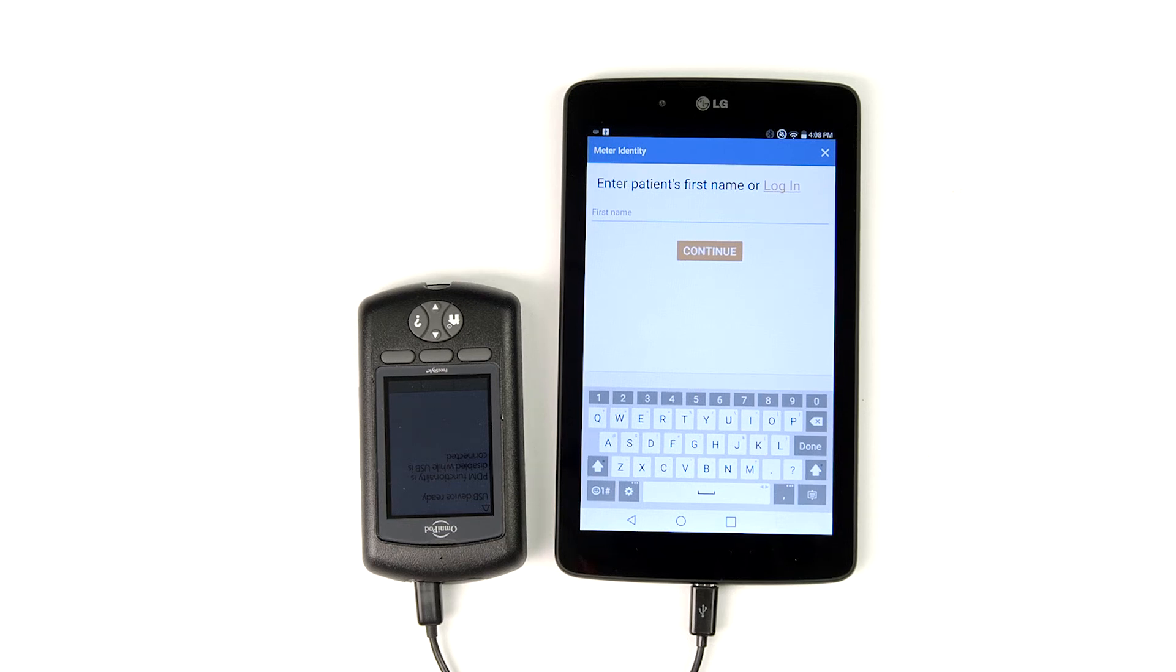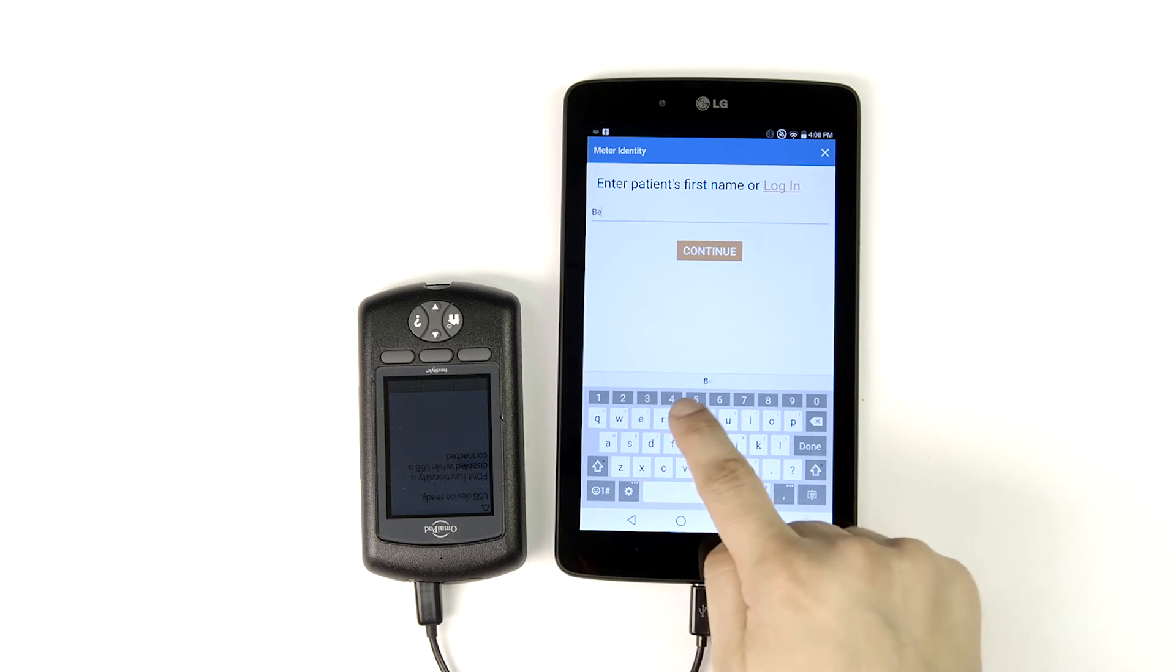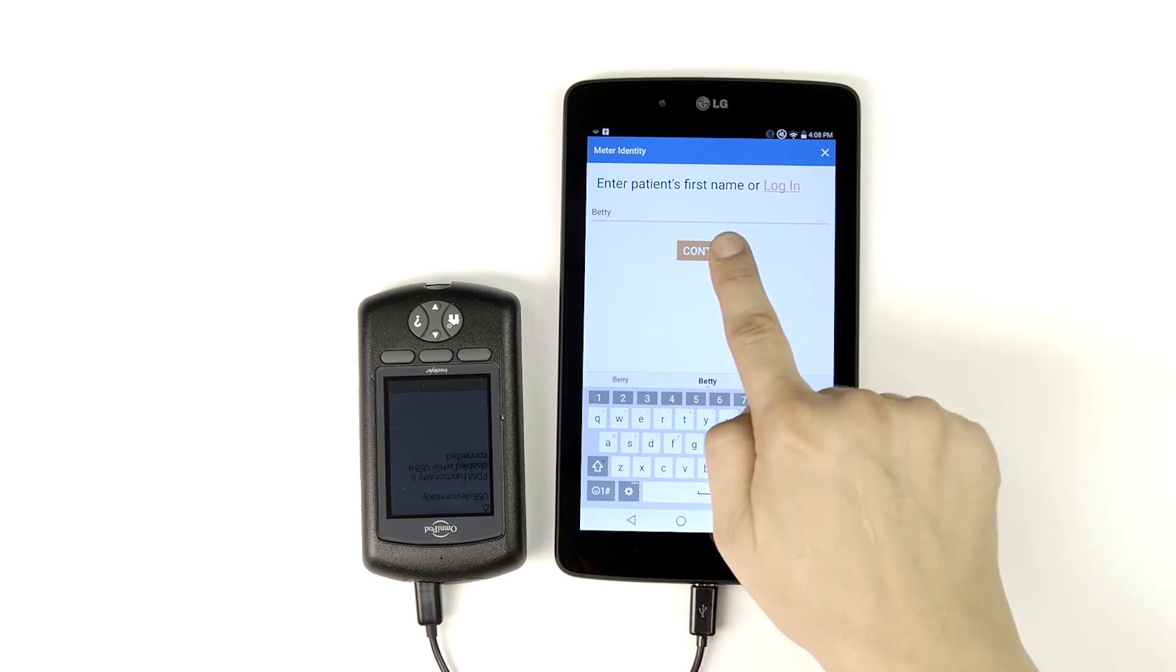Now we're ready to tell Glooko Kiosk who belongs to this device and its data. Type in your patient's first name and tap continue.